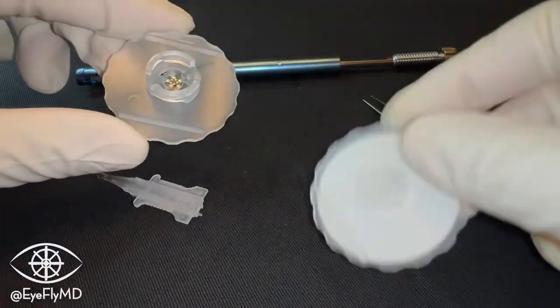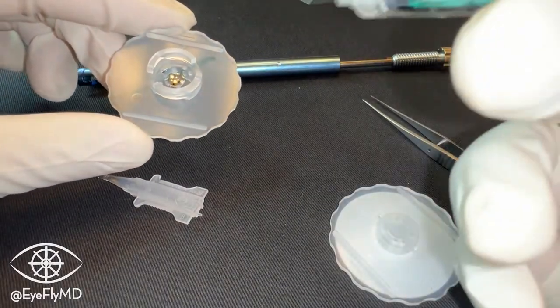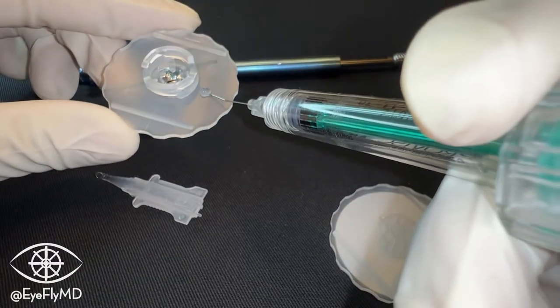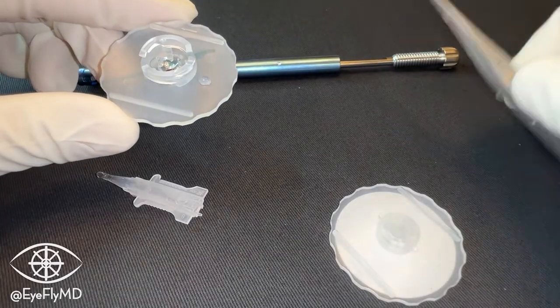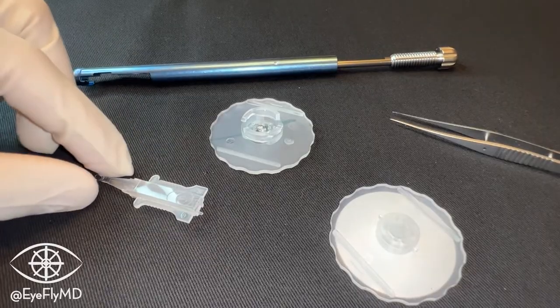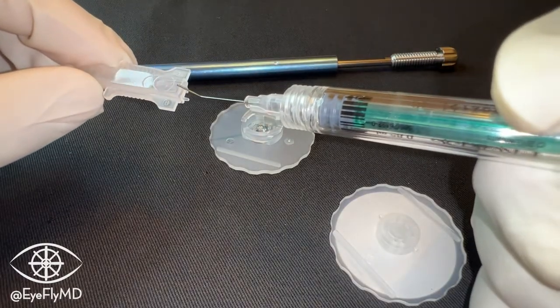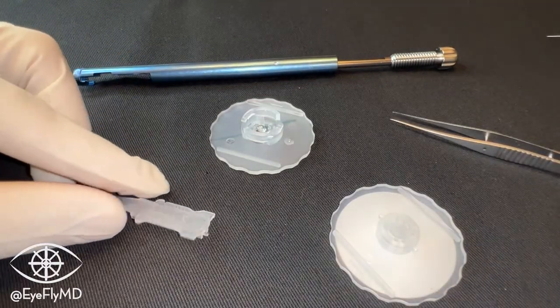Just like last time, we'll open the IOL and place a little bit of cohesive OVD both on the optic portion and off to the side — remember, that's to dip it to make sure the entire IOL is covered. Then we're going to fill this cartridge both from the front and the back with cohesive OVD, just to make sure the entire cartridge is full.